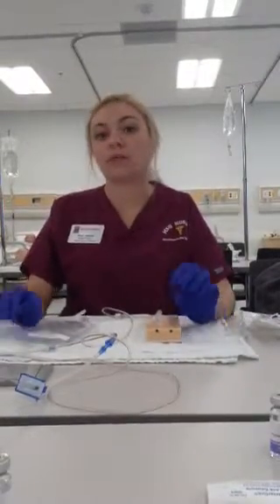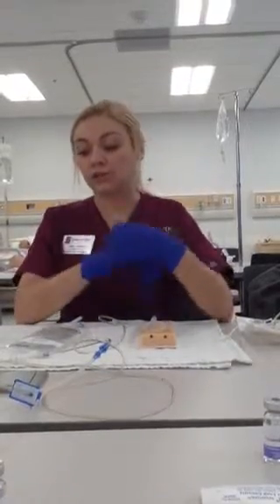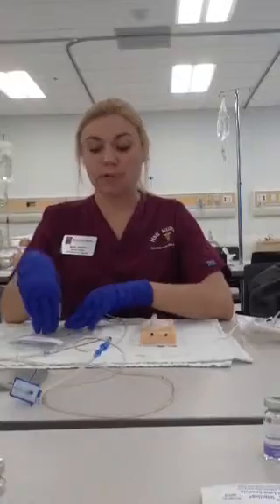So first I'm going to make sure that I do my steps right. So I have to make sure I have the right patient, right medication, the right time, the right dosage, the right documentation, and the right route. So I'm going to double check my medicine with the MAR and with my patient's bracelet and 2 identifiers.